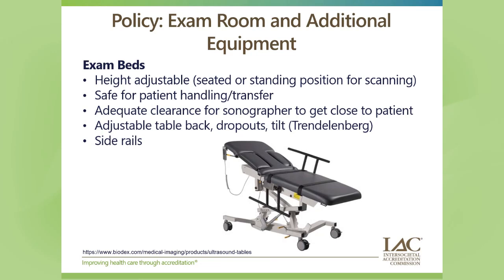Not because you're planning to go transport them in this bed, but just if you need to step away from the patient for a moment, maybe because you need to look at the previous images if you're seeing something new, or have a quick discussion with maybe the reading provider about some findings that you had, putting those side rails up while the patient's on the bed to ensure that they're not going to come out of the bed if you have to step away is important.